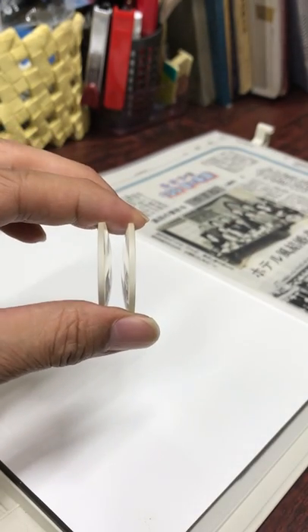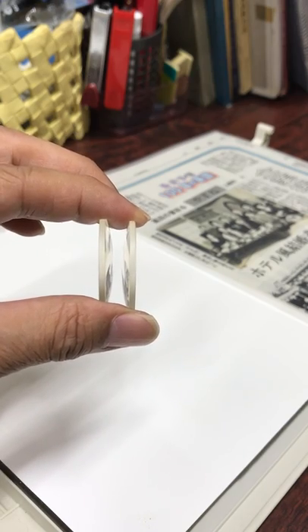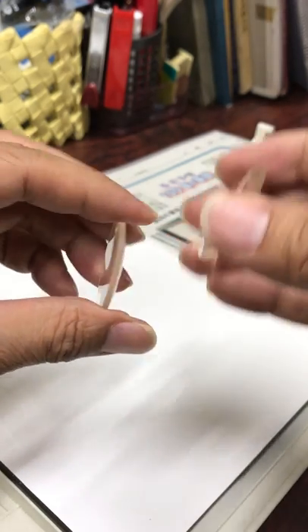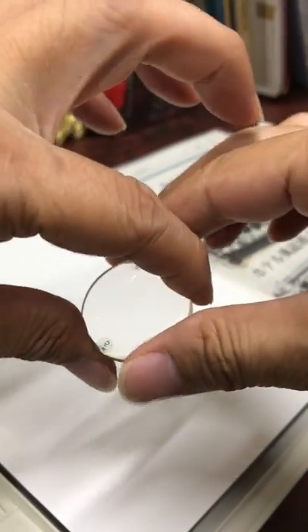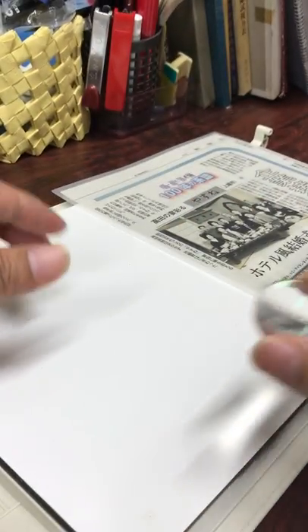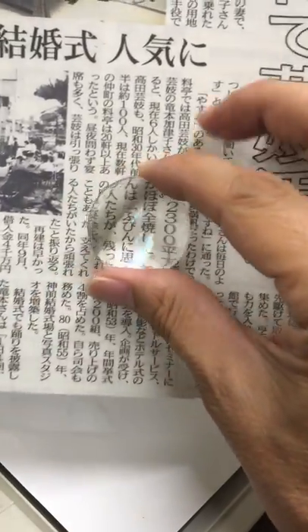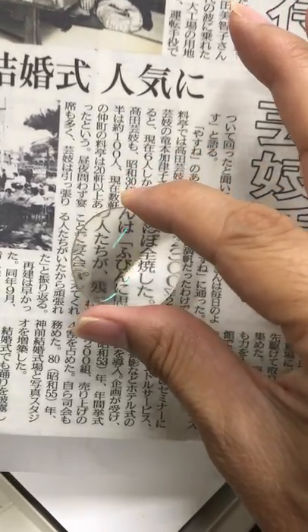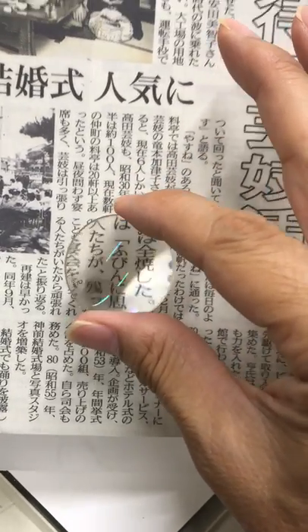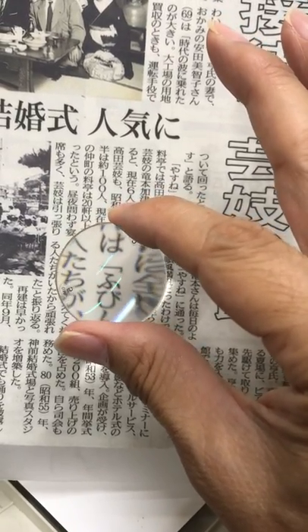Let's compare the viewing between a biconvex lens and an aplanatic lens. First, I look at the paper through a biconvex lens. You can easily find spherical aberration.